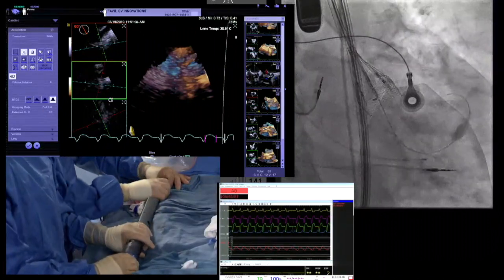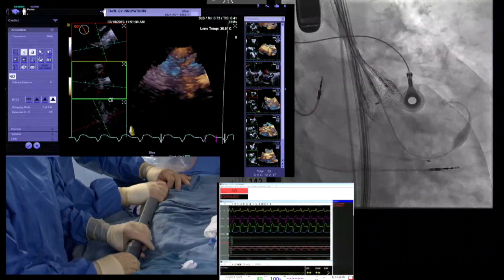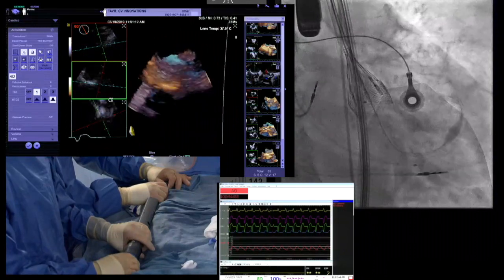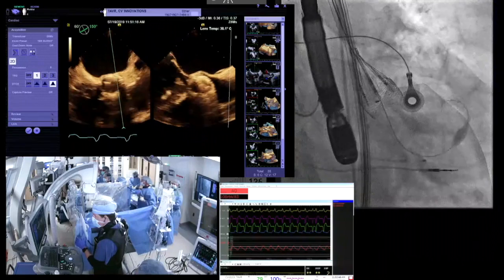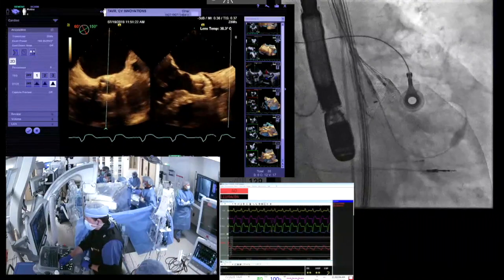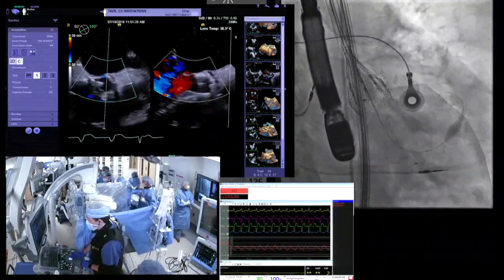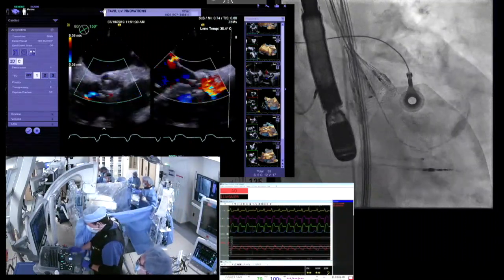We're pretty high right now. Bob, you want to take a look quickly? Sure. In our original implant angle, we looked kind of deep. So we recaptured partially and came back, and now I think we're sitting right at the annulus, what we might call zero angiographically. And we could do a little test here with the contrast just to confirm our pigtail position.